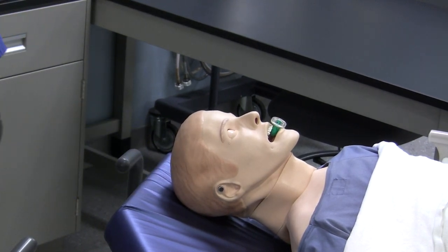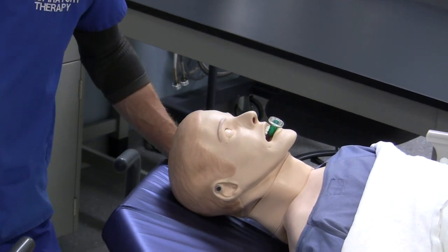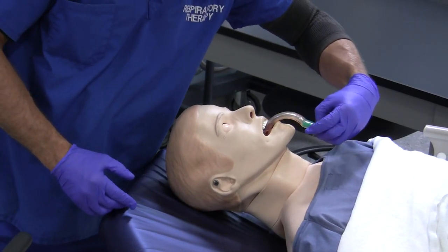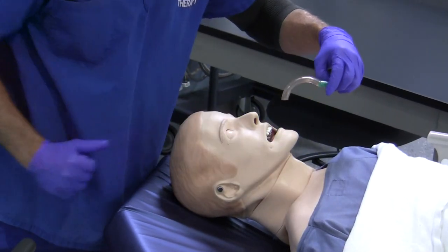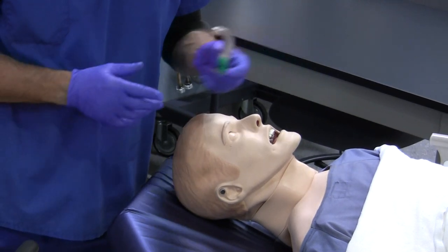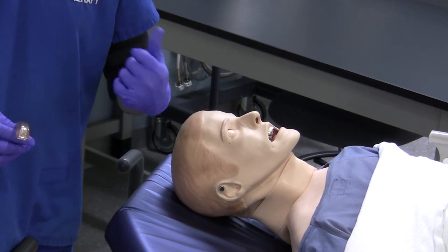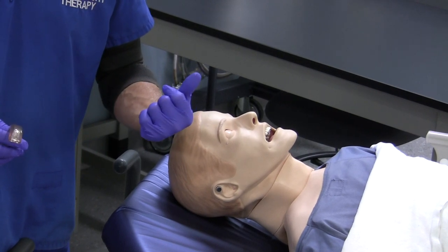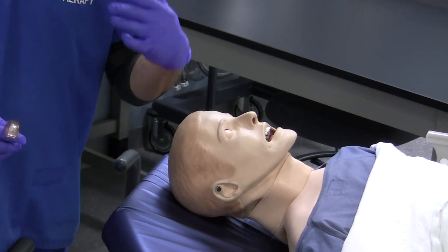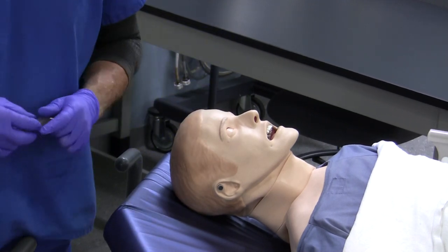To remove the OPA when it's no longer required, simply grab the flange and pull it out, following the natural curvature so as not to cause undue trauma to the patient. Remove the OPA when the patient has an intact airway, is awake and conscious, has a gag reflex, can protect their lower airway, can cough, and can ventilate on their own. Make sure of all that before removing it.